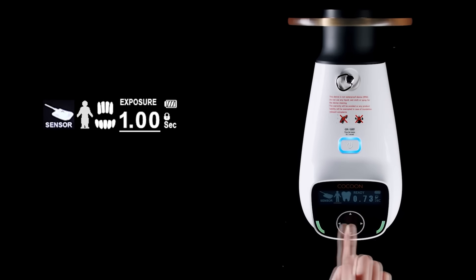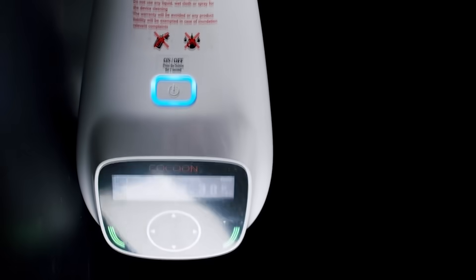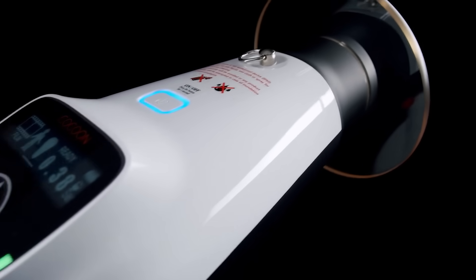This works with every digital sensor and there's nothing that can compare to it across the board. I would highly recommend that you consider the Cocoon as your go-to generator in your veterinary practice for dentistry.